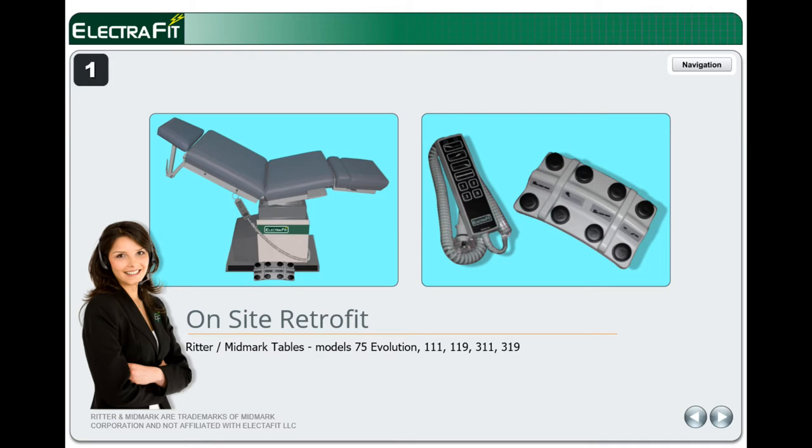This is the on-site retrofit guide by Electrofit Systems for Midmark and Ritter Models 75 Evolution, 111, 119, 311, and 319 Power Procedure Tables. There is an interactive version and a printable version at Electrofit.com.